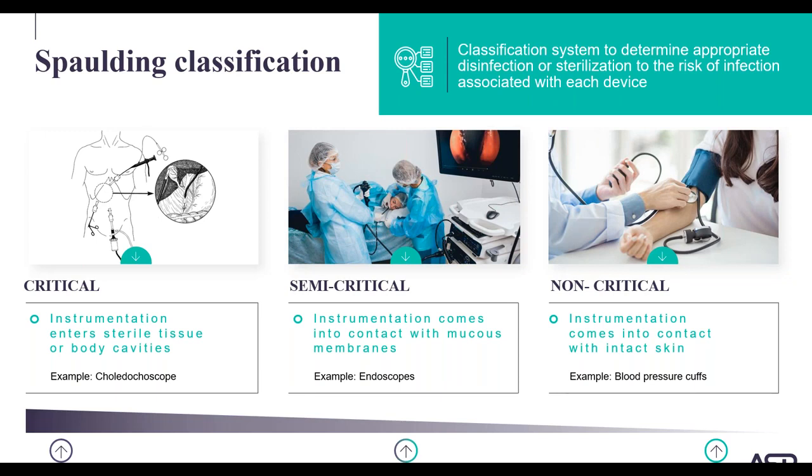And lastly, non-critical devices are those that come into contact with intact skin. So a blood pressure cuff or even a bedpan, those are both examples of non-critical devices that require a minimum of low or intermediate disinfection.